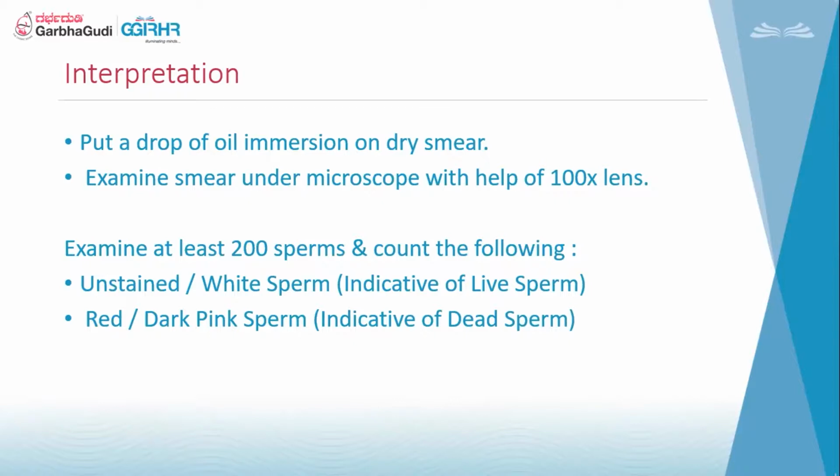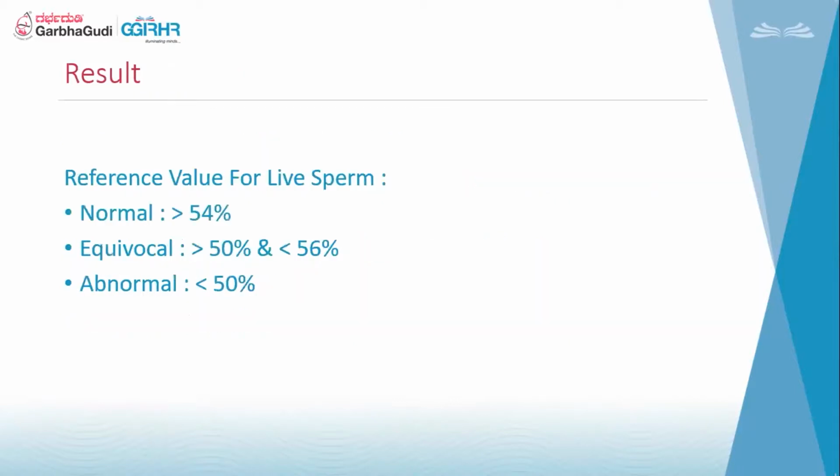That is our viability rate. The reference value for live sperm is more than or equal to 54%.